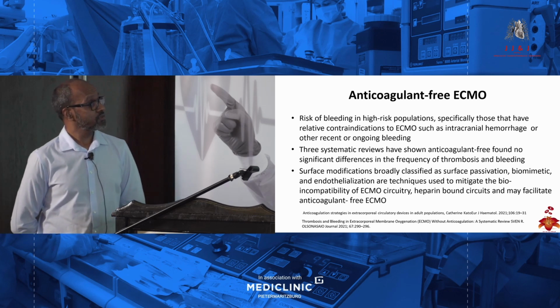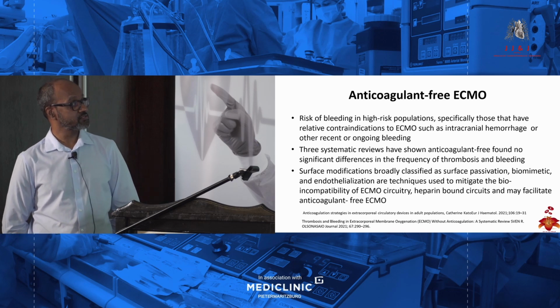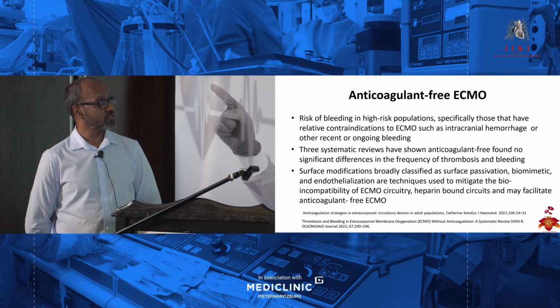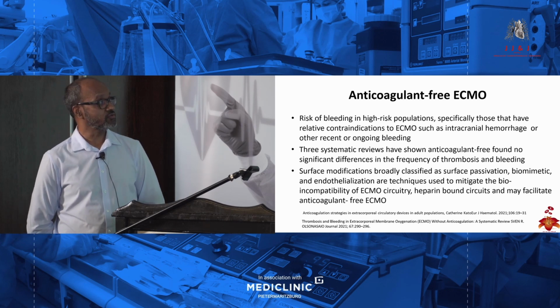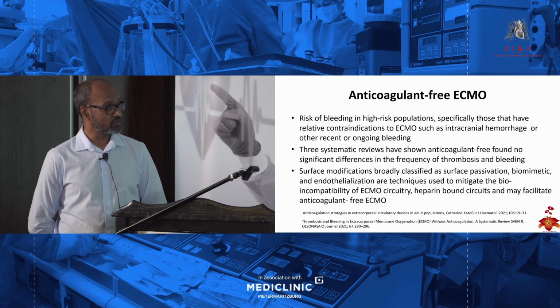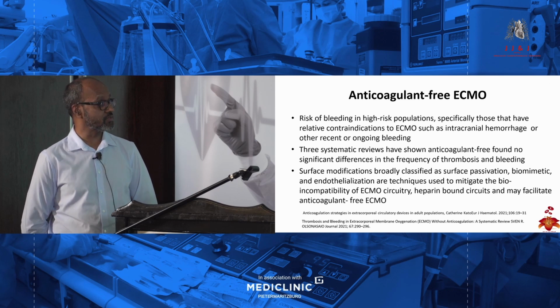So what we know is that in high-risk populations, especially those that have relative contraindications to anticoagulation, for example intracranial hemorrhage or other recent or ongoing bleeding, we can consider an anticoagulant-free circuit. Now, 3 systematic reviews have shown that anticoagulant-free ECMO found no significant difference in frequency of thrombosis and bleeding.